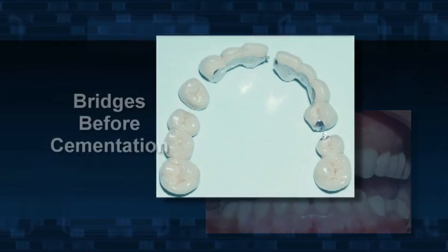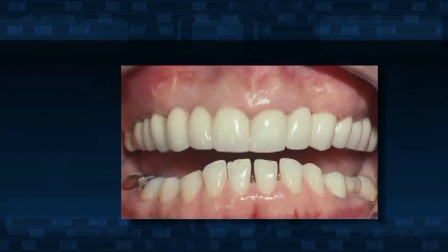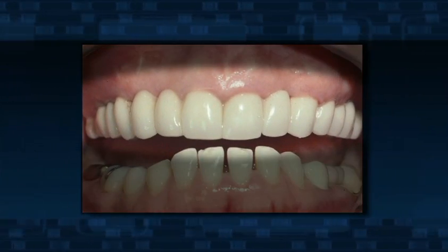Note the bridges as they were made by a dental laboratory technician and the aesthetic result as they were cemented into the mouth. The patient should expect many years of service from these bridges.